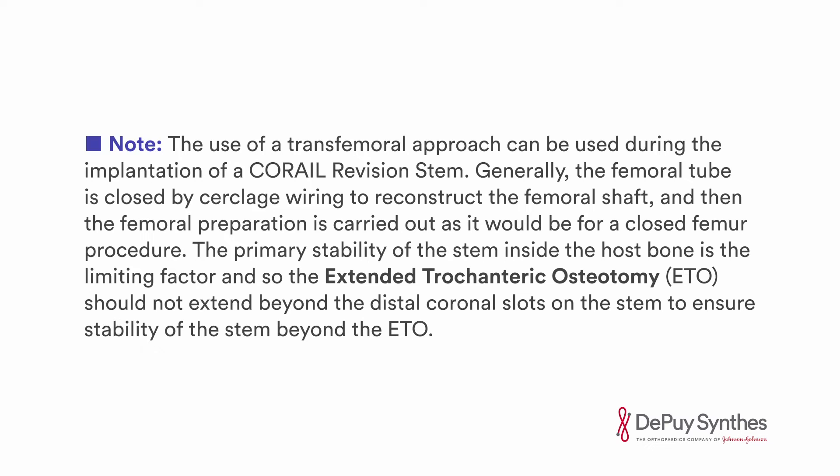The use of a transfemoral approach can be used during the implantation of a CORAIL Revision Stem. Generally, the femoral tube is closed by cerclage wiring to reconstruct the femoral shaft, and then the femoral preparation is carried out as it would be for a closed femur procedure. The primary stability of the stem inside the host bone is the limiting factor, and the extended trochanteric osteotomy should not extend beyond the distal coronal slots on the stem to ensure stability of the stem beyond the ETO.